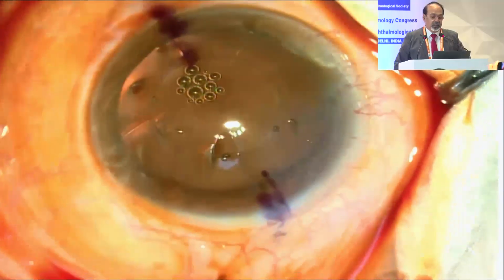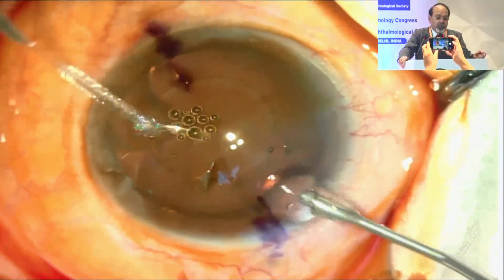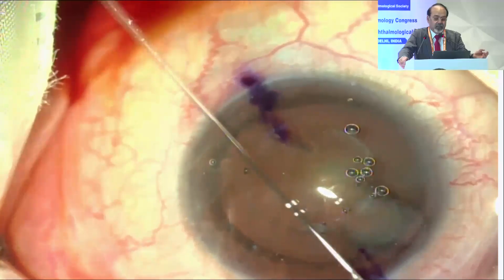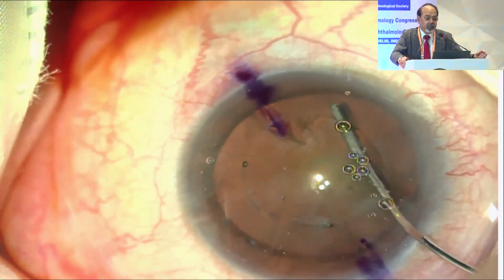You can see that the incision is opened. There is astigmatism in this particular case, so I am going to put a toric Tecnis IOL, because the Tecnis is the best, as already discussed earlier in the question answer.